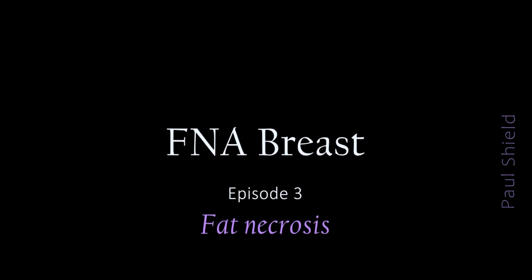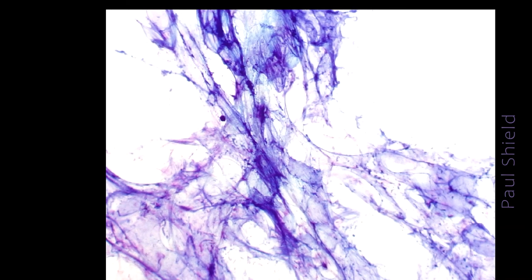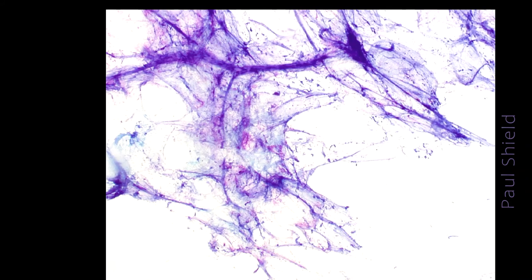Let's look at a couple of cases of fat necrosis. Both of these cases are from patients who've had breast surgery. One was a breast reduction and one was a surgery for cancer. This is typical of what you see. This is really degenerate looking fat. Notice it's got a weird staining quality to it. Sometimes you get sort of yellow staining as well, and it's kind of lost its definition, so it's hard to see distinct adipocytes.